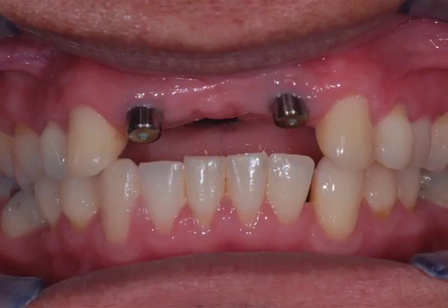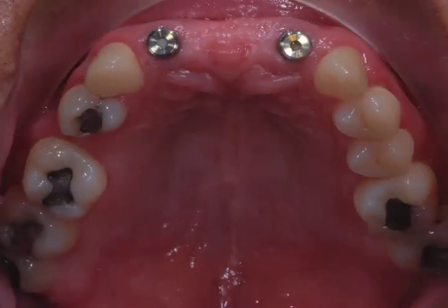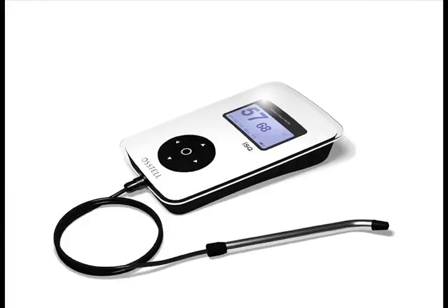The patient returned — this was the first time I saw the patient — returned to the clinic in anticipation of restoration of those implants. As verification that the implants were in fact integrated, here are some pictures showing the intraoral condition of his mouth. You can see he presents as a healthy dentition ready to be restored. A Panorex verified the position and placement of the implants, and we used the Osstell ISQ device to check the integration. He came up with an ISQ number of 78, which is very good on the scale. We also used a counter-rotation torque wrench to verify no rotation of the implants, confirming about 35 newton centimeters. He had no rotation at 35 newton centimeters, so we deemed the case satisfactorily integrated such that we could place the permanent restorations.